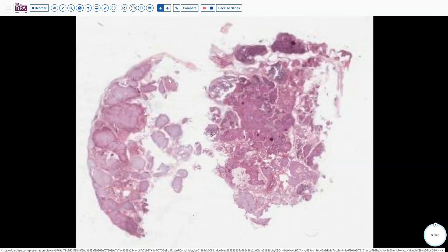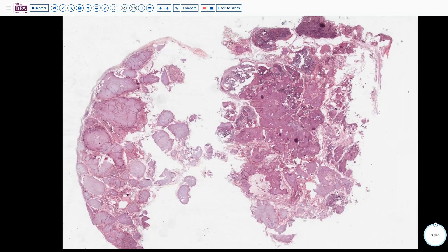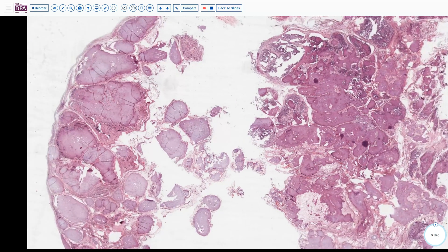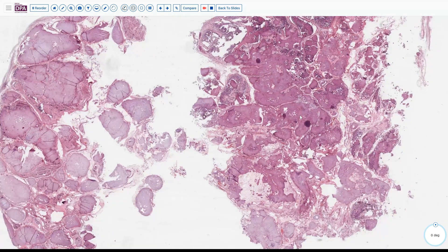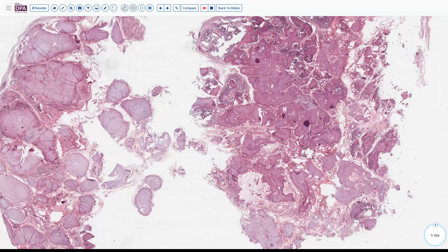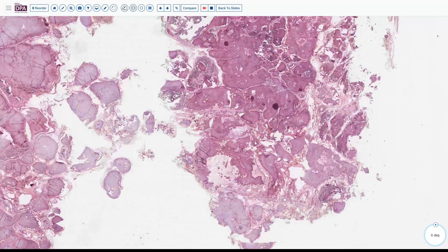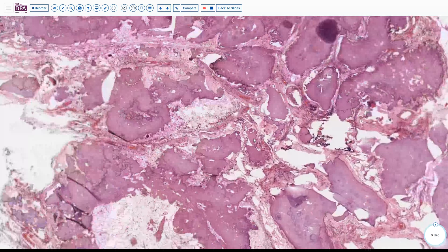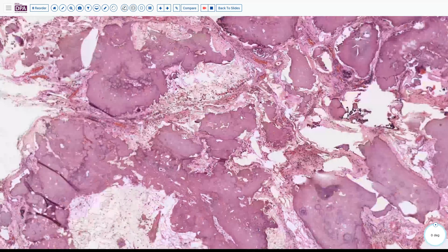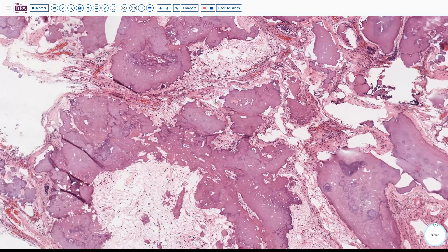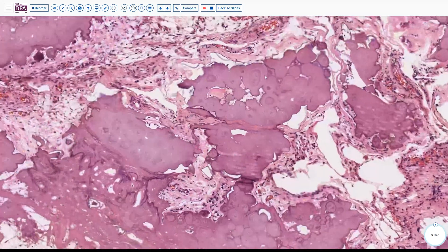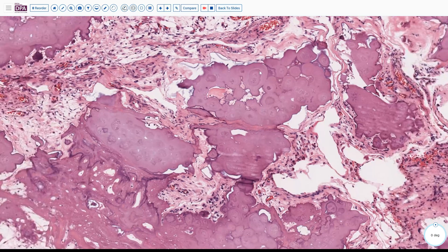Under the microscope we have a picture that corresponds to the ultrasound findings. We can see a lot of eosinophilic material, pale blue areas, and not very many cells in this particular pattern. At higher magnification we can see that this is calcified, with a lamellated, almost psammoma body type of appearance, with these rounded nests and concentric laminations.